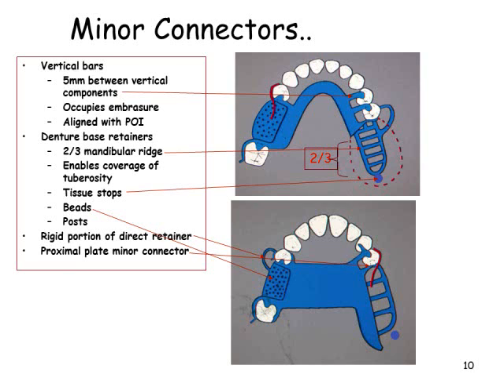It should conform to the interdental embrasure, passing vertically from the major connector to the other components. It should be thickest toward the lingual surface, tapering toward the contact area. Generally, the minor connector should form a right angle with the major connector, so that the gingival crossing may be abrupt and cover as little of the gingival tissues as possible. When a minor connector contacts tooth surfaces on either side of the embrasure in which it lies, it should be tapered to the teeth so that the tongue may encounter a smooth surface. Sharp angles should be avoided, and spaces should not exist for the trapping of food debris.